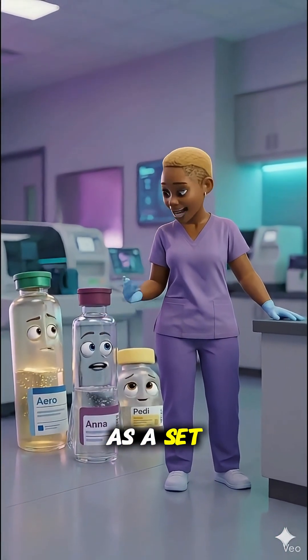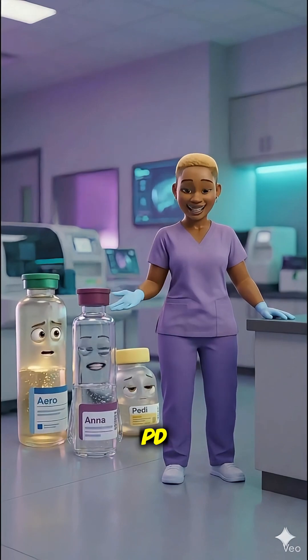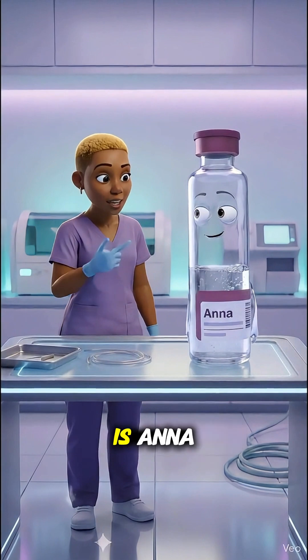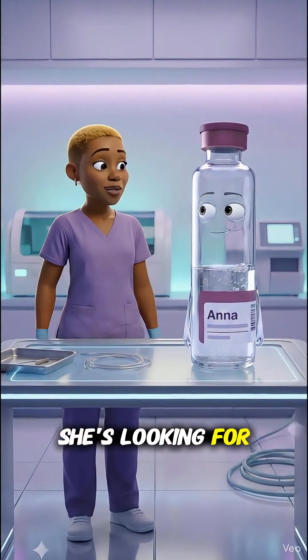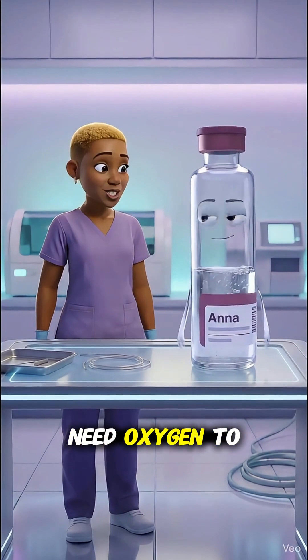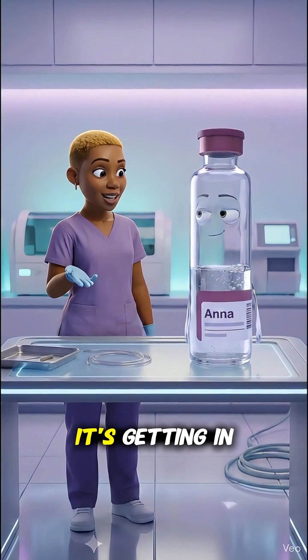They always come as a set. This one right here is Anna. She's anaerobic — she's looking for bacteria that don't need oxygen to grow. So oxygen isn't helping her; it's getting in the way.